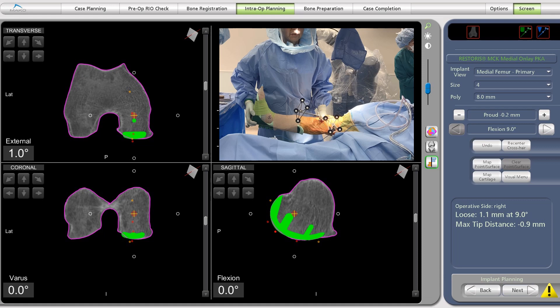Once we've looked at our 3D reconstruction and gone through our process of soft tissue balancing, we will then begin our final stage of fine-tuning, where we will look at the knee in all the different planes. We'll look at it axially and then at the proper amount of rotation. We'll also look at it coronally or head-on, and then sagittally, making sure that the partial knee replacement completely follows the contours of the native knee.